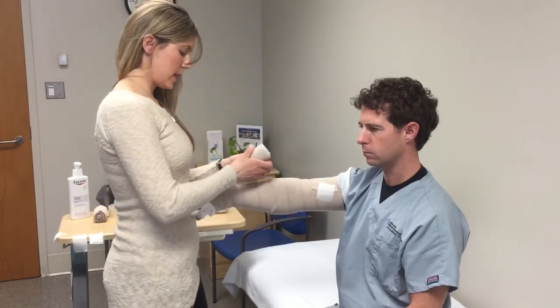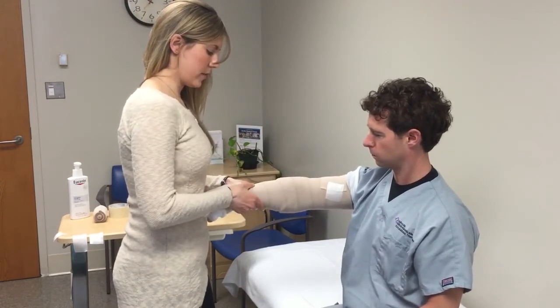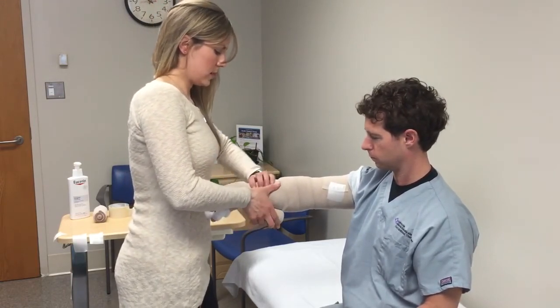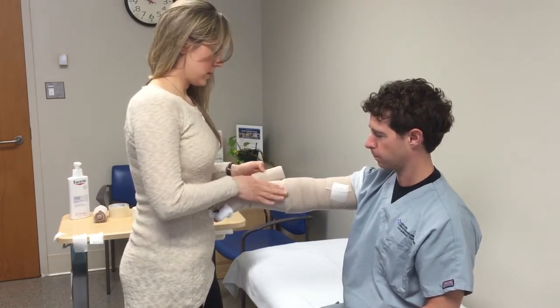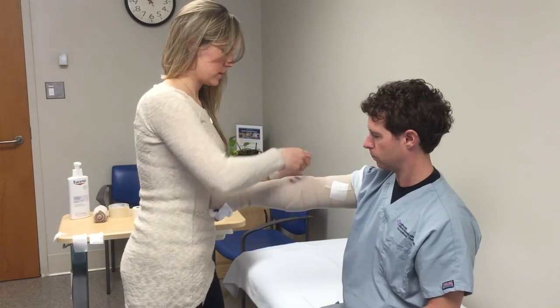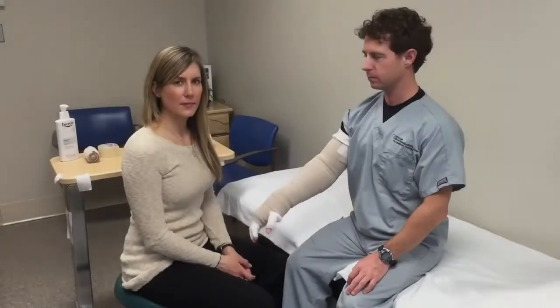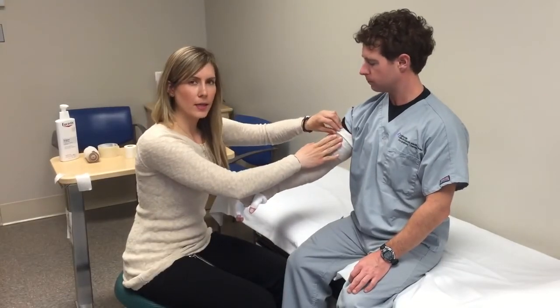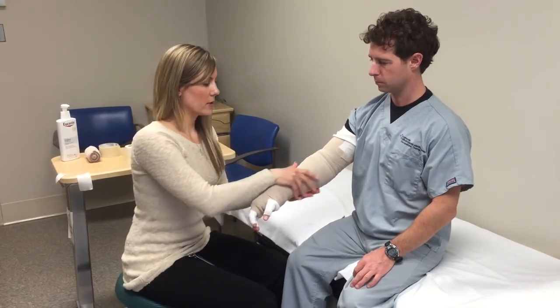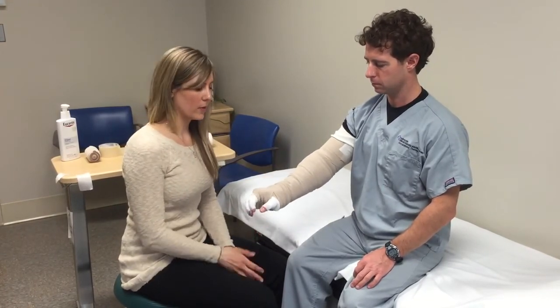Once you've secured the last bandage with tape, continue after checking the pressure. Start where it feels soft — smooth the bandage and give it a gentle pull as you come around, remembering to cover about 50% of the last spiral, and work your way up. Secure the bandage with tape. In some cases your therapist will have you do a fourth bandage. When you're done, check that the pressure feels good to the patient and that they can reach their mouth and function with their bandage on.